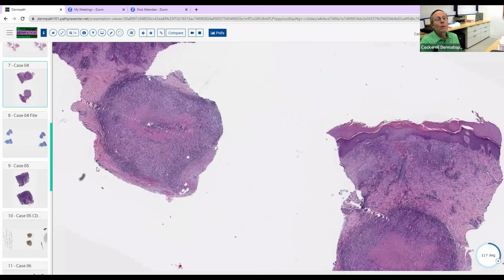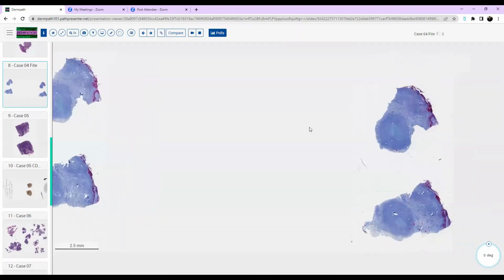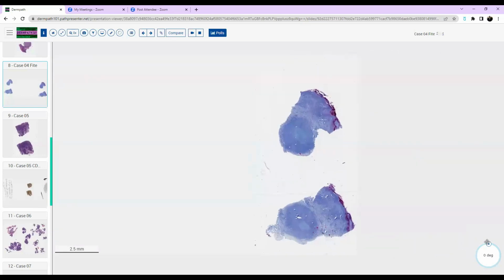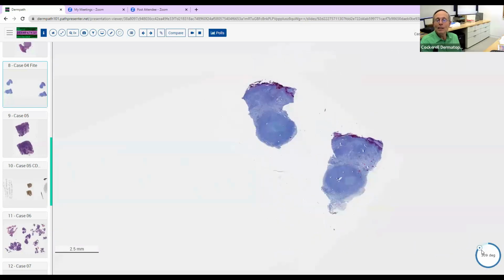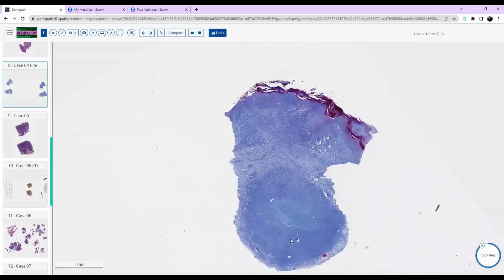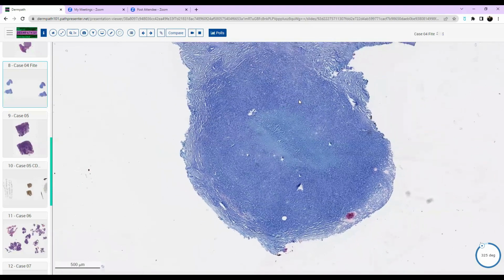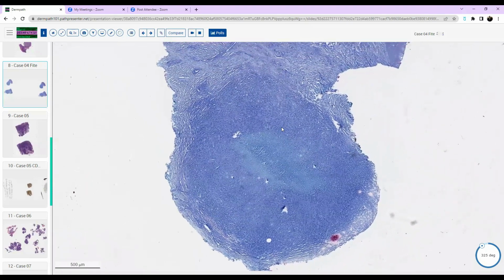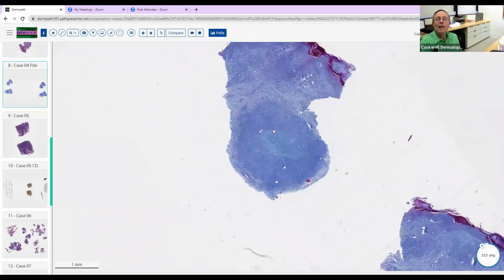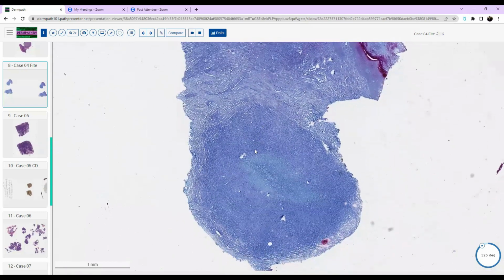And then actually here we have a gift for you. We actually gave you a special stain. Yeah, Fite stain. So how did you know it was a Fite stain? I would kind of assume. I tried looking through it, and there's usually some highlight of the pink areas. What's the color of a Fite stain? So I think it'll stain acid-fast bacteria pink.